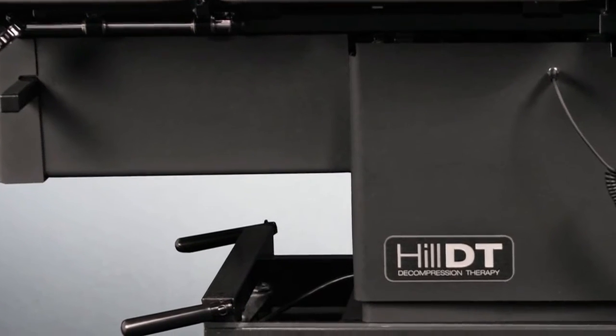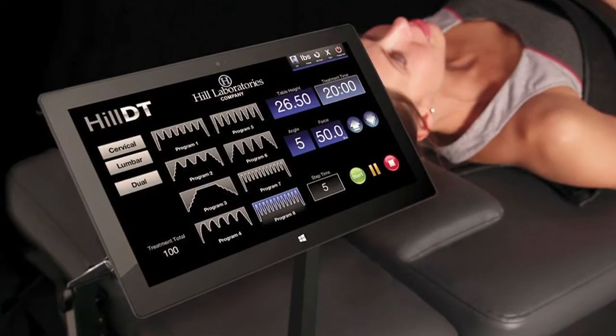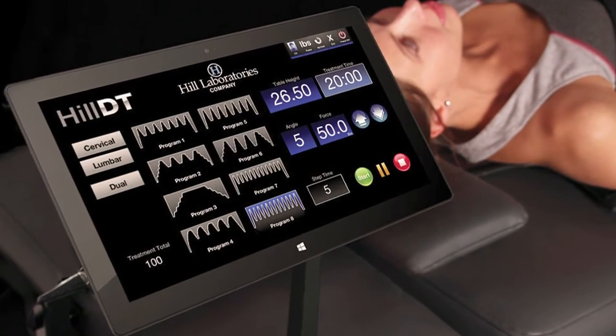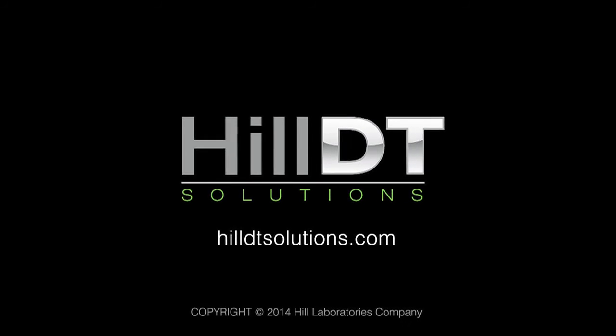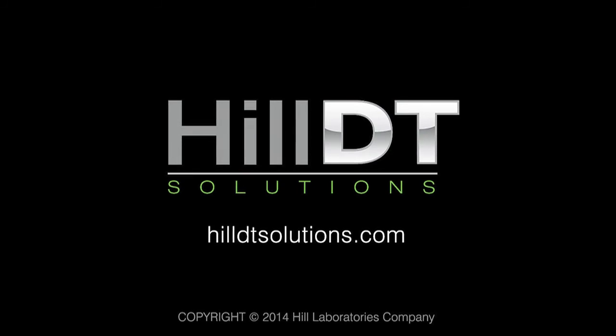This video presentation is a brief overview of the Hill DT features and is not a replacement for the comprehensive certification training program. To learn more about the Hill DT decompression table and certification training, visit HillDTSolutions.com.